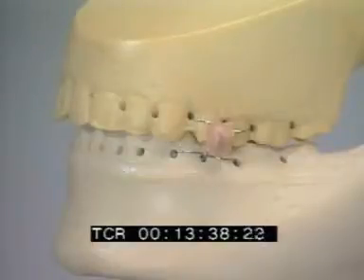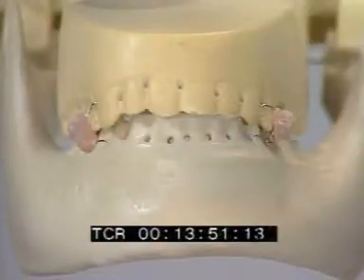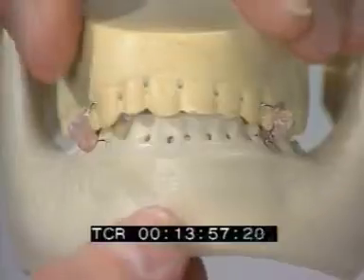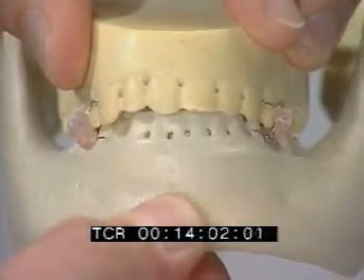Additional stabilization can be obtained by using methylmethacrylate to reinforce the ligature. The methylmethacrylate is placed around the wire to protect the gingiva from thermal injury and to make removal of the wire easy. Monomer is used for the final molding. Functional load brought to the mandible shows the degree of stability the system has.